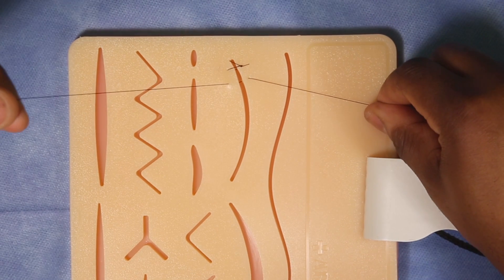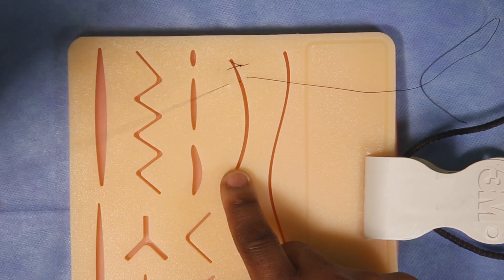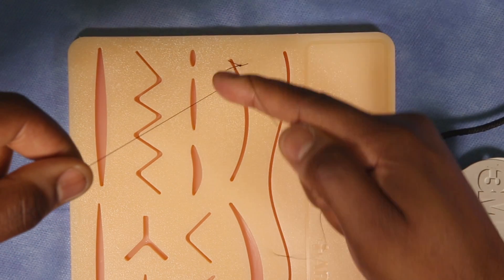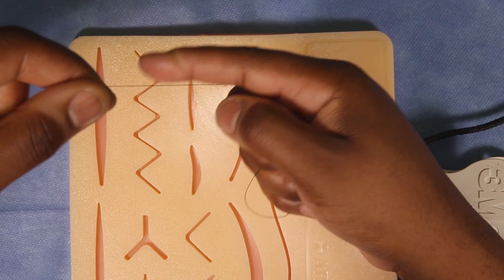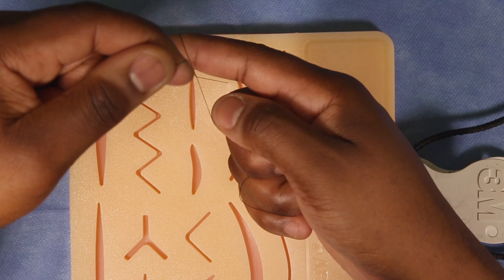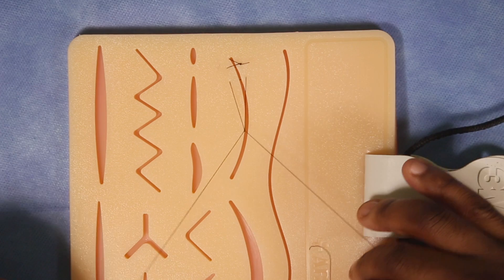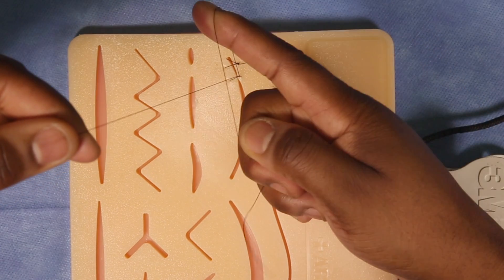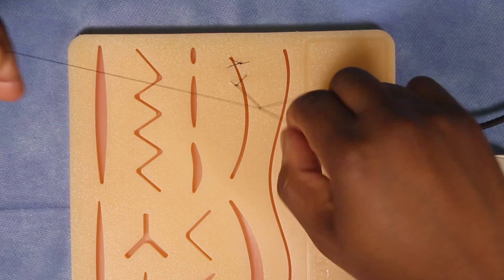For the one-handed knot, your left hand is the post — keep it still and everything pivots around it. Your right hand throws the suture around the post. Point your index finger out, invert it, and overlap your right hand with your left. Use the end of your index finger to grab the portion right next to your thumb, touch the two together, then grab and pull it through. You can see the knot going down.